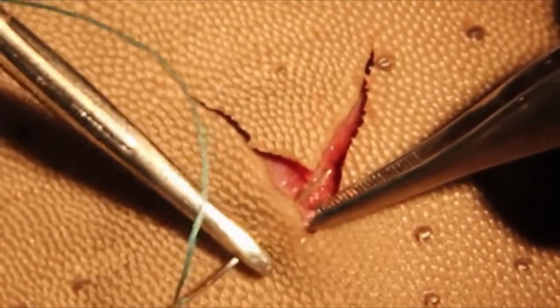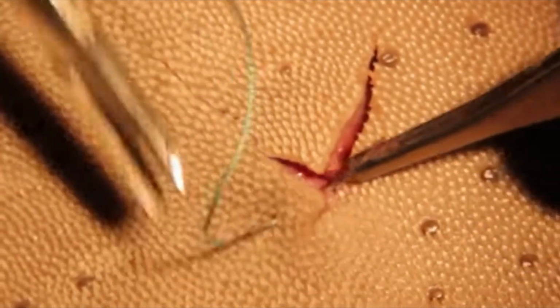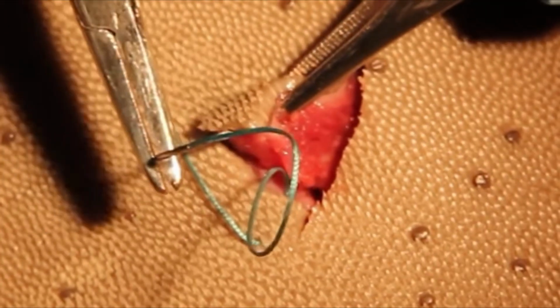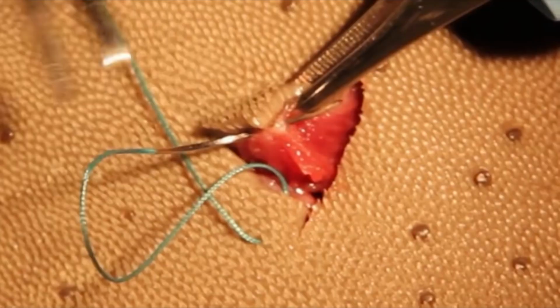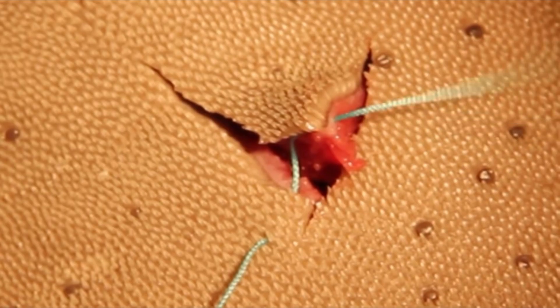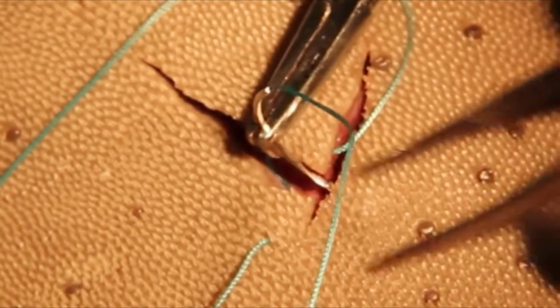Take a bite through the dermis so the needle travels from the skin side down into the subcuticular plane. This creates the first half of the mattress path and sets the height for the corner. Now the critical step. Take the bite through the corner flap, but do not pierce the very tip. Instead, pass the needle underneath the corner in the subcuticular plane, from subcuticular to subcuticular, so the suture captures dermis under the tip without cutting through it.